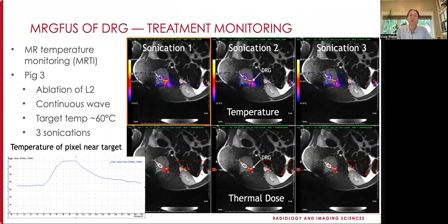processes in pigs compared to humans, direct targeting was hindered and required adjustment of the focus to the proximal spinal nerve root. Temperature estimation worked well in continuous sonications. In the longer duration pulse sonications, MR imaging exhibited a temperature drift and required correction in post-processing.